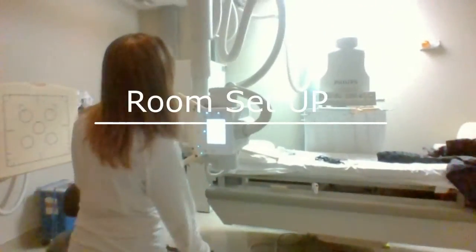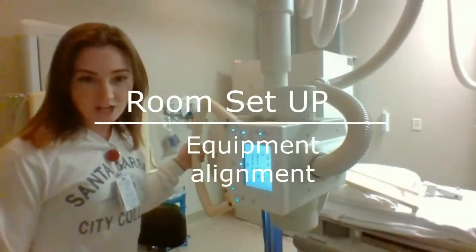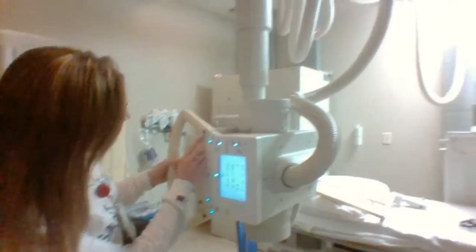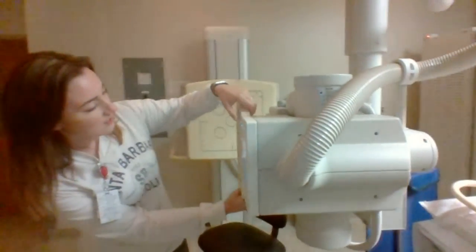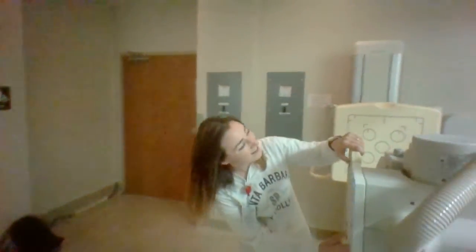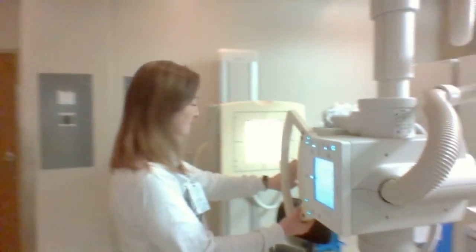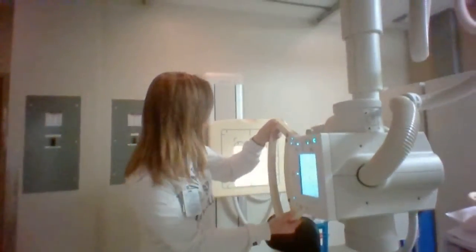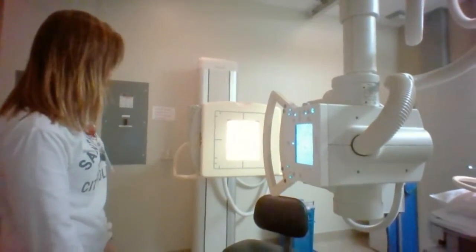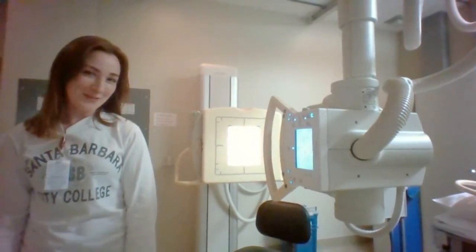I'm going to set up my room. For all sinus projections, you are going to want to be at 40 inches. So I'm just going to bring it on over this way. Okay. And I'm going to crop. There it is. Okay, so now we've got it at 40. It's detented to the bucky, and got it that way, set horizontally to the wall. So now I'm going to go get my patient.